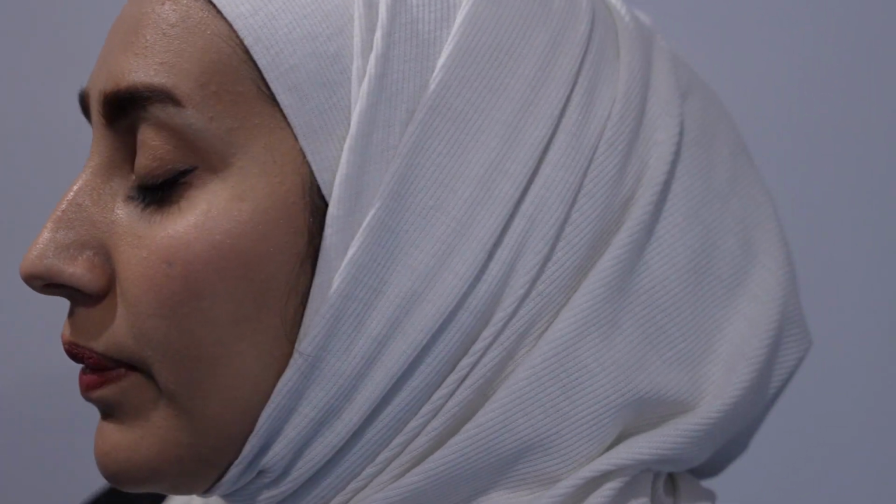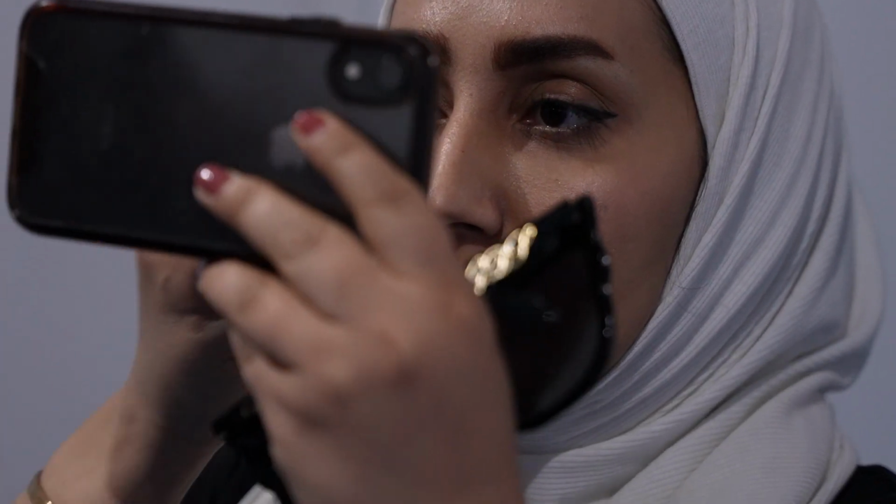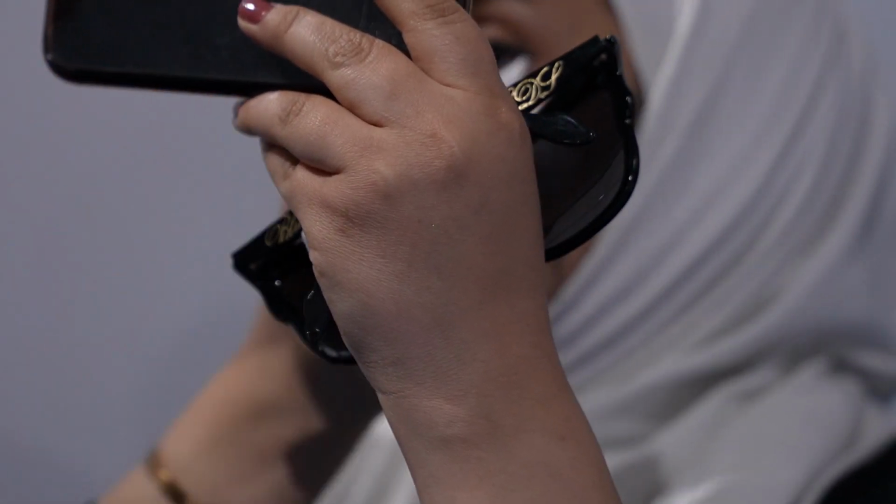The duration to remain, but the much larger the cross linkage, the G prime will be harder, the gel will be very hard, and the lips will not look natural during speaking or during movements. So for how long? Usually we expect that from 4 to 6 months it will remain. The problem of re-injection is not a problem. It's not like Botox, where we're afraid of producing sensitivity or antibodies so that the Botox does not work.